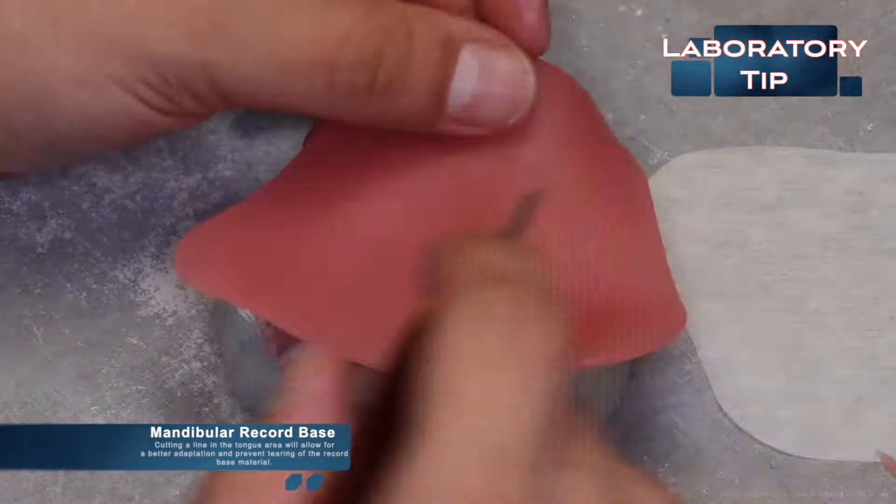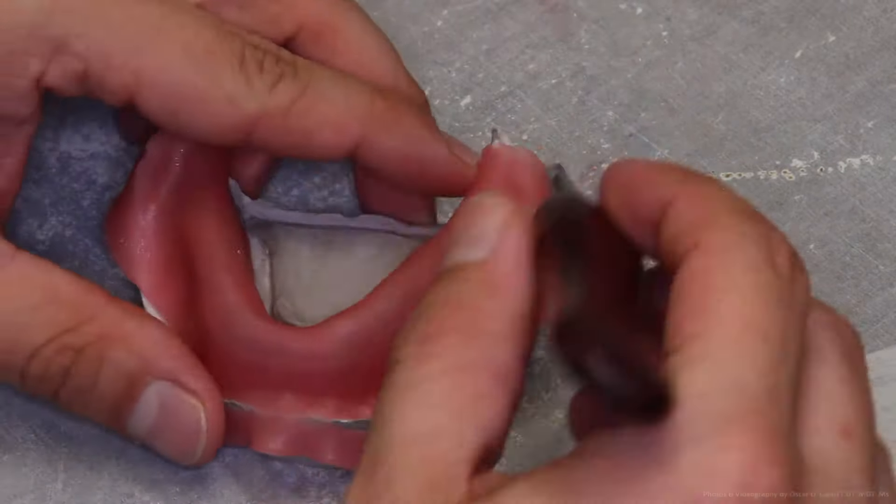Trimming the excess on the mandibular is the same as performed on the maxillary. Ensure that the record base borders are extended fully into the sulcus areas, and on the mandible ensure that they cover the retromolar pads.